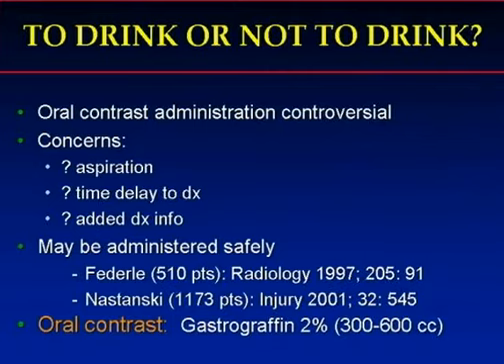But there are many studies that have been published that show that you can administer oral contrast safely, including a study that was published by Federle in 1997, where he evaluated 510 patients and had no adverse reactions, and a study by Nastansky, who evaluated over 1,000 patients, and of the patient population, only one of these patients had aspirated the contrast material. So we do try and give Gastrografin whenever our surgeons will allow it to be administered.